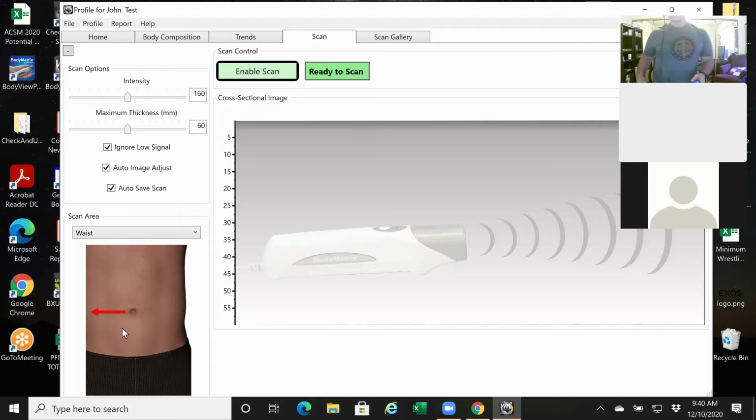Okay, so I'll do the honors. You can see up at the top, there's that enable scan button. Exact same thing as measure point in our one-dimensional measurements. So we can be hands-free as well performing the scan. So I'm going to just spread the gel here. My objective is to make sure the device slides real smooth and easy on the surface.